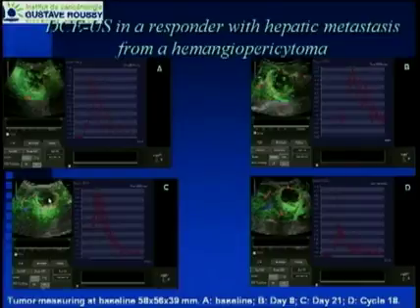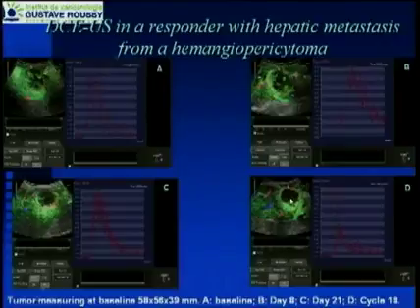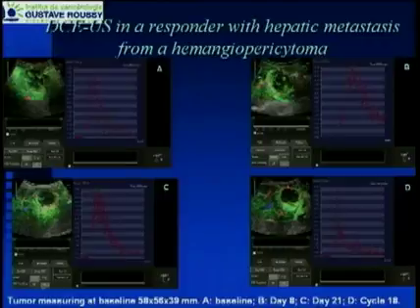So, a very strong necrosis. And we confirm this necrotic area after cycle 18. It's very rare to have a long follow-up. Remember, the PFS for the phase 1 patient is only 3 months. But finally, after 3 weeks, we are able to demonstrate that this drug is probably very useful for this patient.